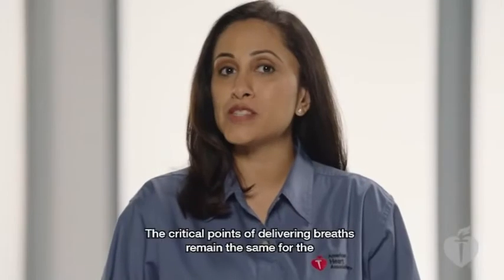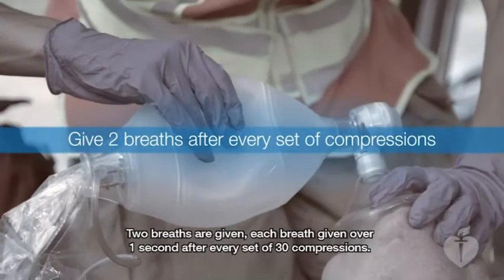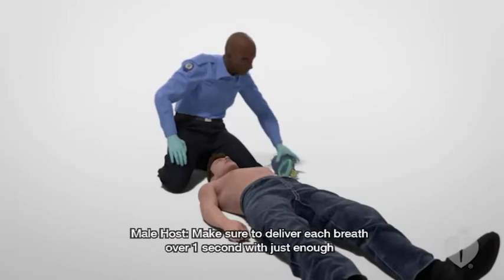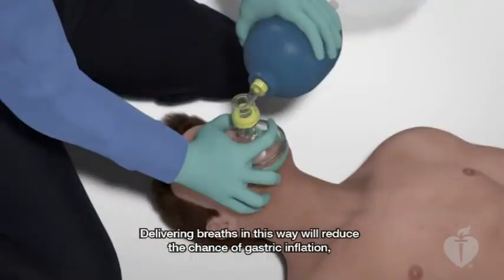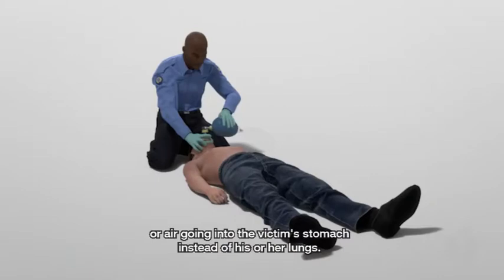The critical points of delivering breaths remain the same for the bag mask device as for the pocket mask. 2 breaths are given, each breath given over 1 second after every set of 30 compressions. Make sure to deliver each breath over 1 second with just enough volume to make the chest rise. Delivering breaths in this way will reduce the chance of gastric inflation or air going into the victim's stomach instead of his or her lungs. Gastric inflation can cause vomiting and possible aspiration.